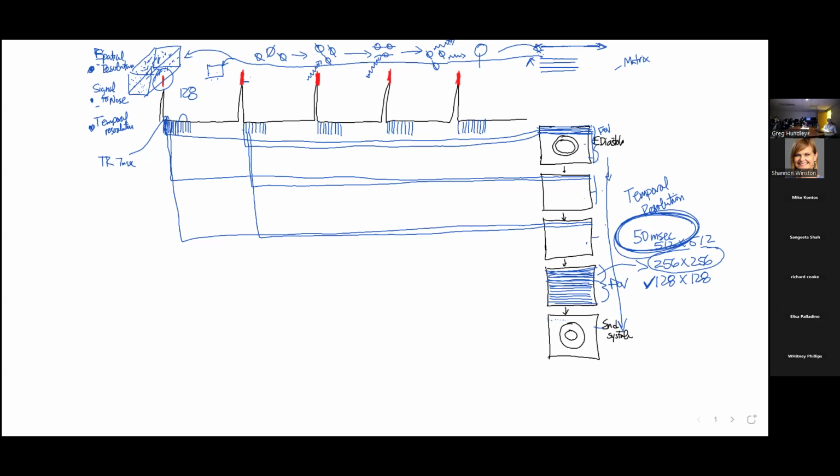And so what's going on is this is all captured. When you hear that sound, that is all these guys, it's just cranking along, collecting these. Okay. And then the computer at the end says breathe, and it stops.